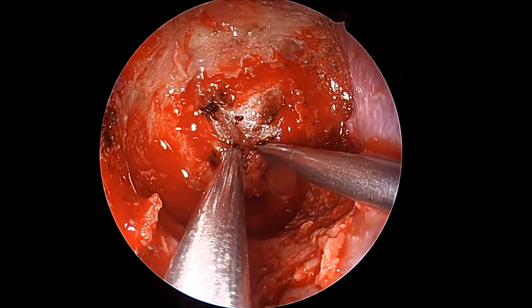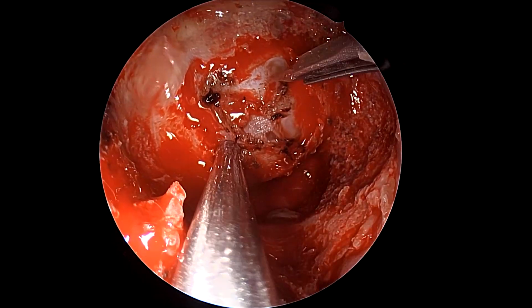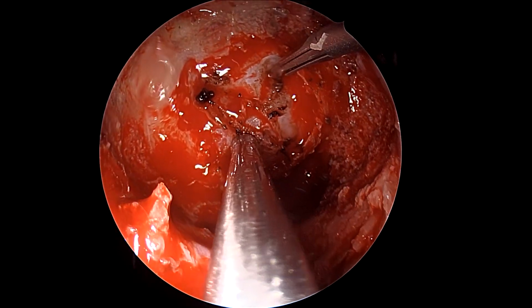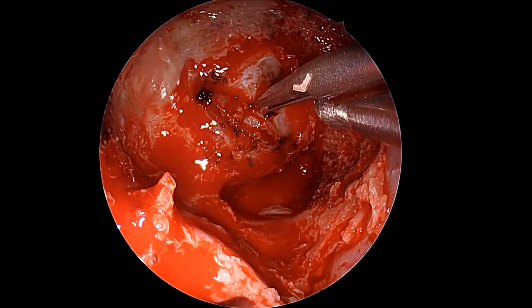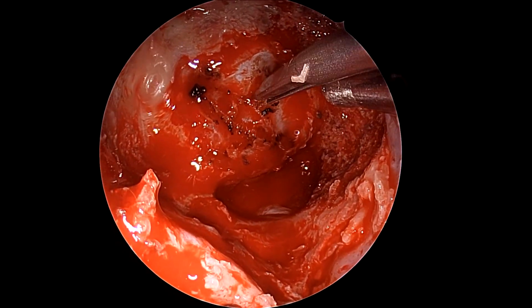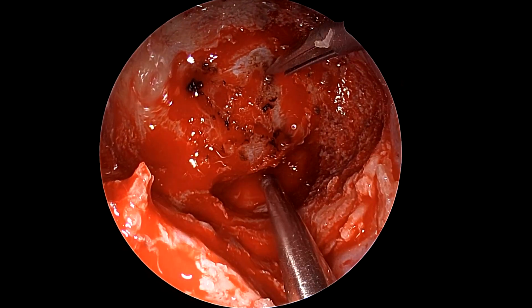Once you open the Sellar, you also get into the tumor consistency and how it's behaving. A very hard or fibrous tumor should obviously be probably best left without done too much, and just with a biopsy. In this patient, we don't even have a biopsy report as to what it is, given the fact that this was treated 20 years back in some other institute.